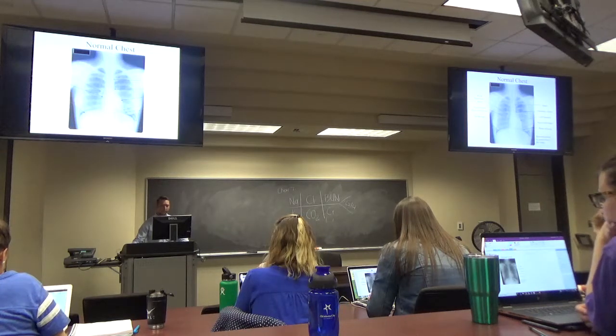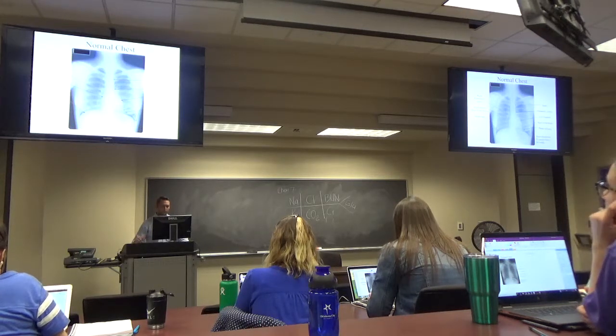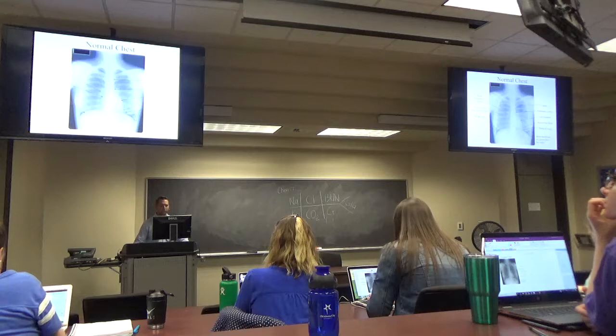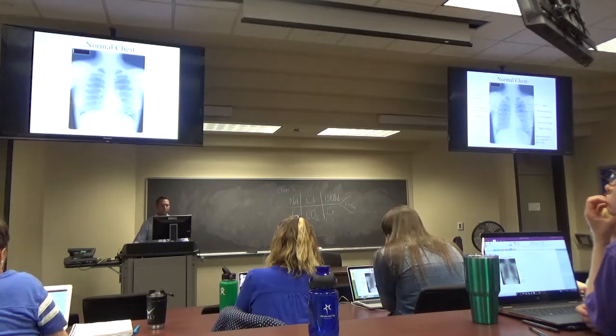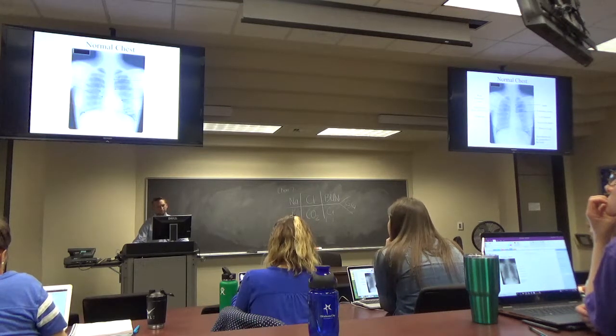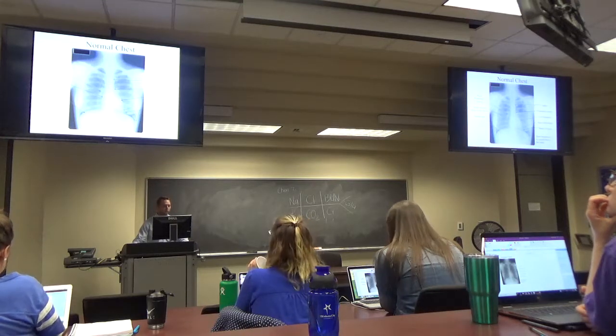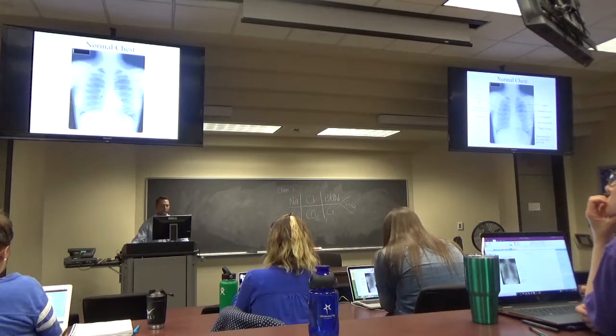Right here we have the right atrium, left diaphragm. See the costophrenic angles are clean right here. Nice, very clear. You can distinguish them easily, so there's no pleural effusion. This is a normal pulmonary artery picture. This as well. Sometimes these can get really engorged, and that's kind of pulmonary arterial hypertension.